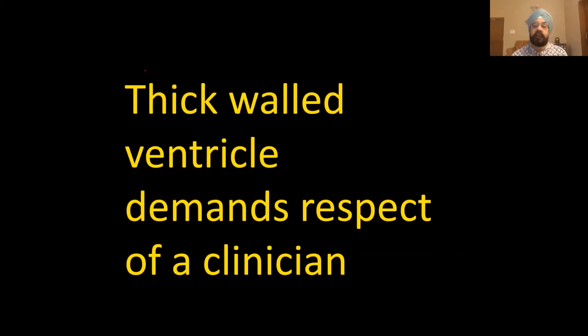Wonderful, sir. Dr. Rakesh wants to know, is there any role of stress echo in hypertrophic cardiomyopathy which you've described? Sometimes some people have used low-grade stress to actually provoke gradients. Having said that, more than that, I wouldn't say that there is any role. You sometimes can show SAM, but then the specificity of exercise-induced SAM goes down. I would strongly suggest not to put people on a stress test in a patient with hypertrophic cardiomyopathy because stress can be arrhythmogenic in hypertrophic cardiomyopathy.